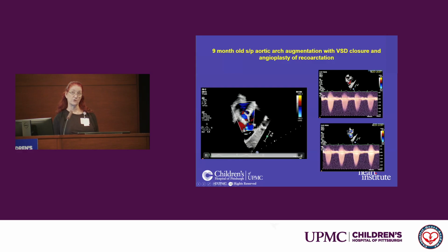We've picked up supravalvular AS from aortic cannulation sites. We've found a lot of things, and it's only really seen in this view, if you have a child small enough. These didn't show up very well, but when they focused on the aortic root, they got a gradient of about 45-50. When they focused more up in the ascending aorta, they got gradients that were more 70 to 80, raising the concern from an echo perspective of supravalvular AS that we're not really seeing very well by 2D.